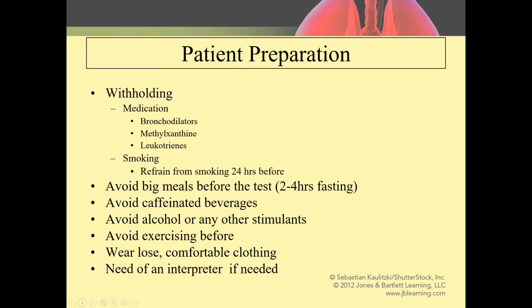So the patient preparation. You get a patient coming in, and we have a pretty active pulmonary function testing lab. They schedule the patients from about 7 till 5 or 6 at night. It's very, very active, actually a revenue generator for the system and for our department. So preparation is certainly important to be able to get accurate tests. And when I say in and out, they want to get their test done and they want to get home. So to get that testing done and move on.